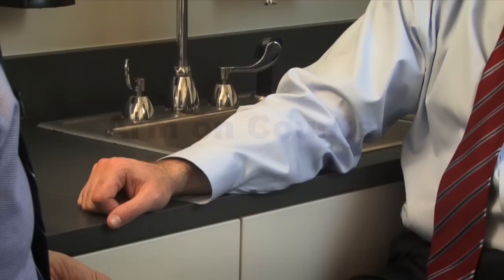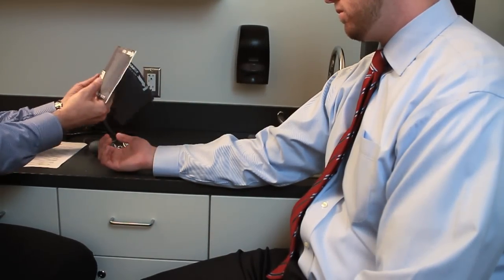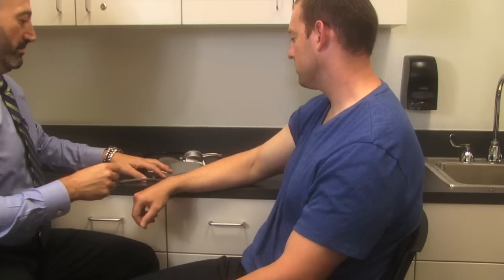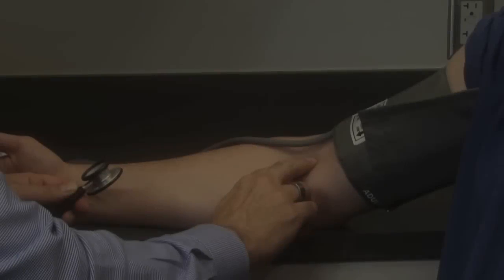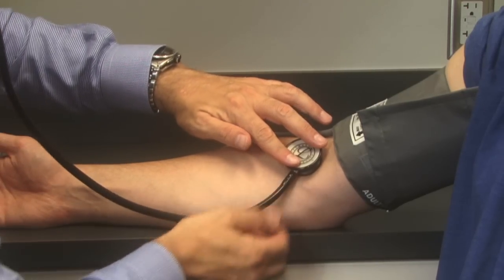Now we have our patient and we need to prepare his arm. We routinely measure blood pressure in the seated position, placing the cuff on the upper bicep. It is recommended for the most accurate measurement that the cuff be placed directly on a bare arm. Prior to the five-minute rest period, I had him remove his shirt and sit with just an undershirt on. Now that he's rested, I can place the cuff on his upper arm and the stethoscope head on bare skin.